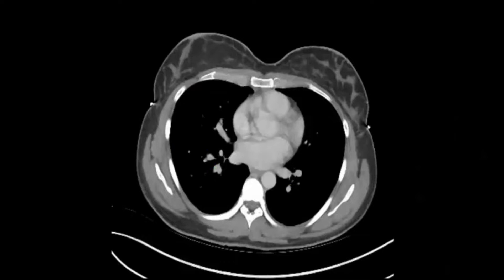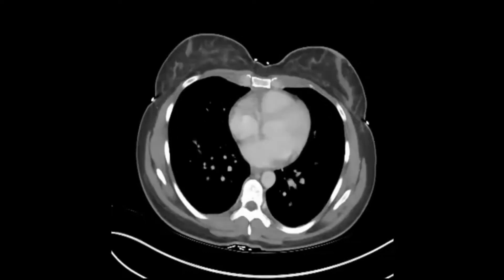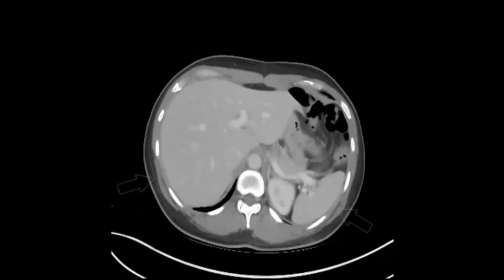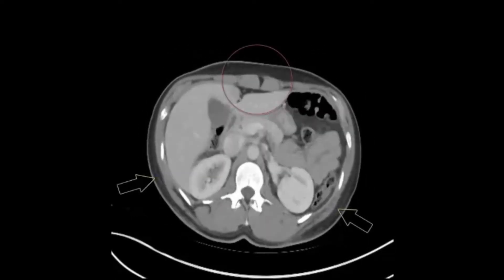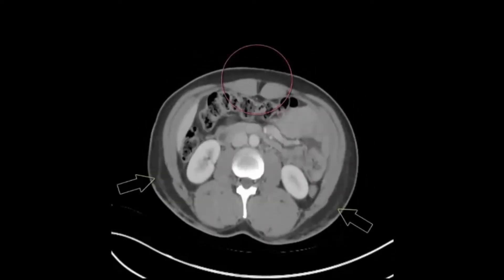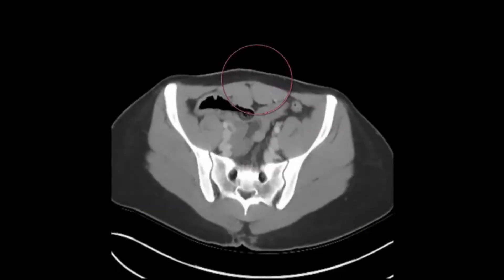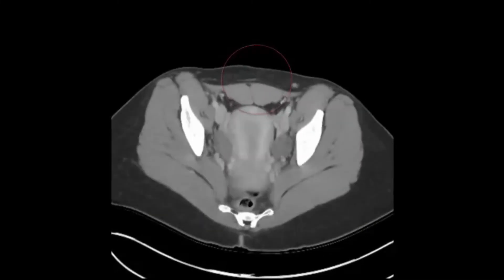Here is the full scan showing the extent of the postoperative changes in this patient with a distant prior history of lipoabdominoplasty. The red circle follows the course of the midline crowding of the rectus abdominis muscles, while the green arrows outline the liposuction cannula tracts.